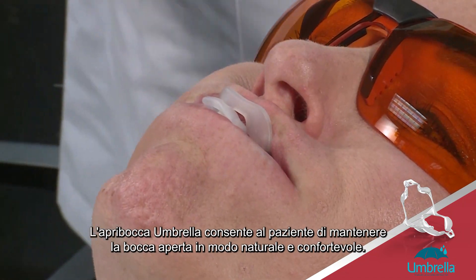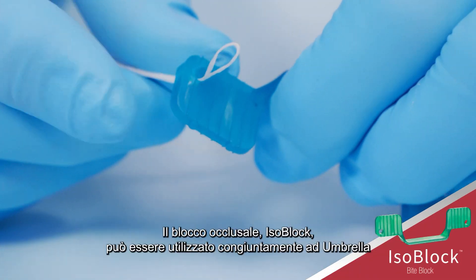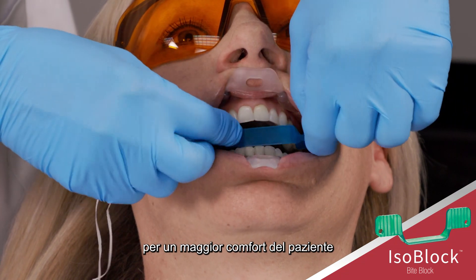Using the Umbrella Retractor helps the patient stay open in a natural and comfortable position. The isoblock can be used in conjunction with the umbrella if the patient is not able to rest passively with the umbrella in place.